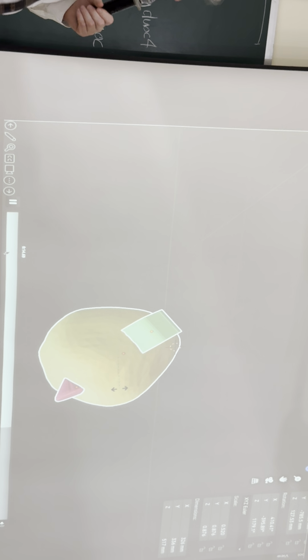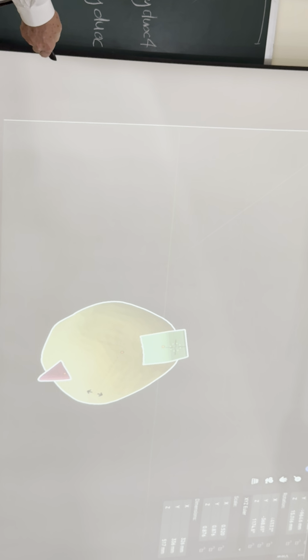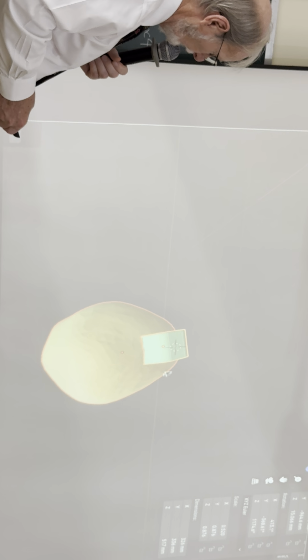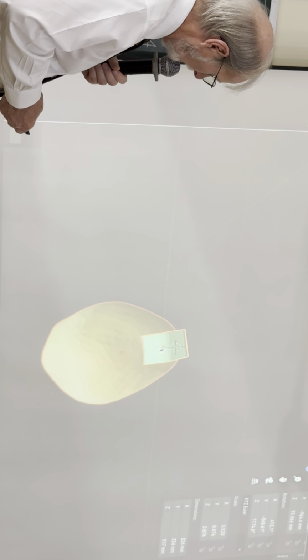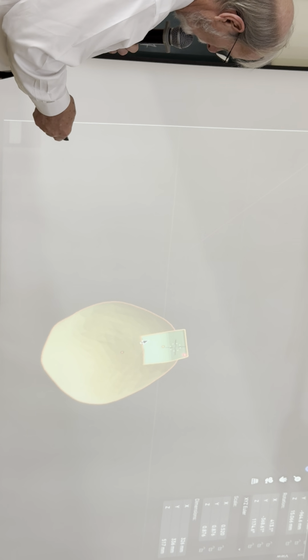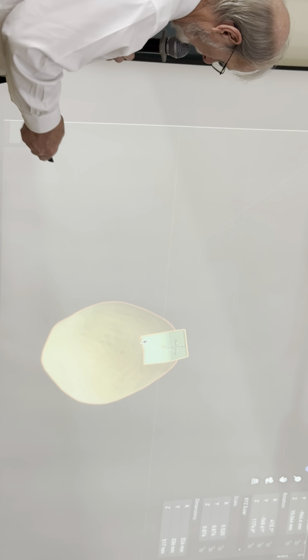So why is it interesting, and I'm playing with this at the moment, to put two attachments instead of, what is the force difference? You see the difference? If you have only one, then you get a rotational moment, yes you do, but what else did you get? This is the distance, this is the force application, this is the distance to the center of rotation, so it's going to push, right? Absolutely. The problem is what?